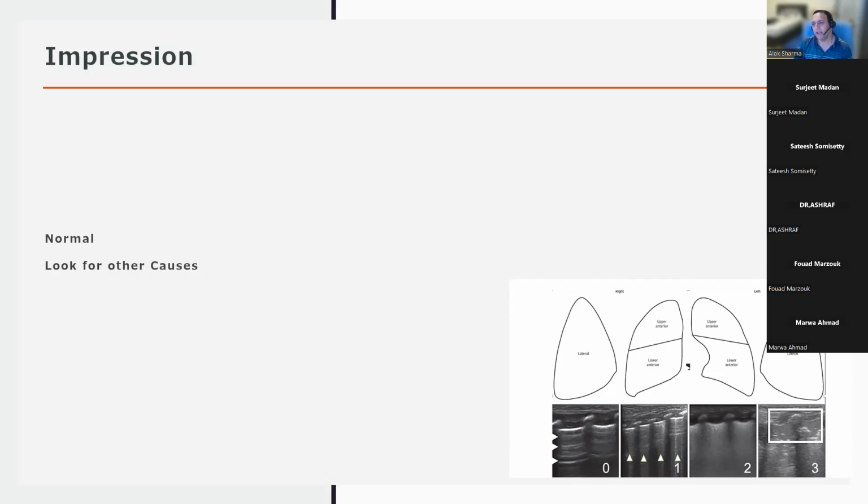Does any of you use posterior scoring? Dr. Ashraf, do you use posterior zone scoring? Yes, sometimes. And if the posterior segment is found to have more atelectasis, can I use this, because the severity will be increased compared to the anterior score.